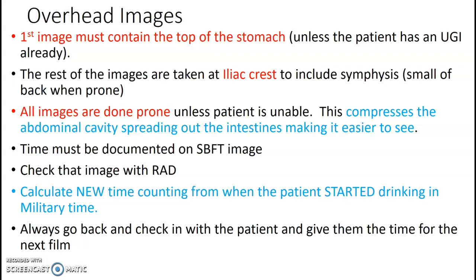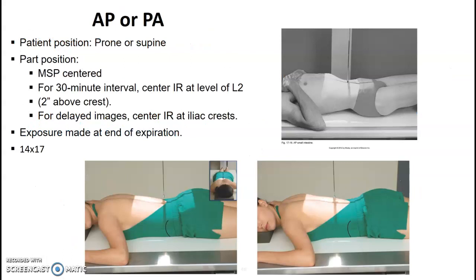Always check back in with the patient, give them the time for the next image. Say, hey, we're going to do your next image in 30 minutes or 40 minutes or whatever it is, so they're not just sitting in that room waiting.